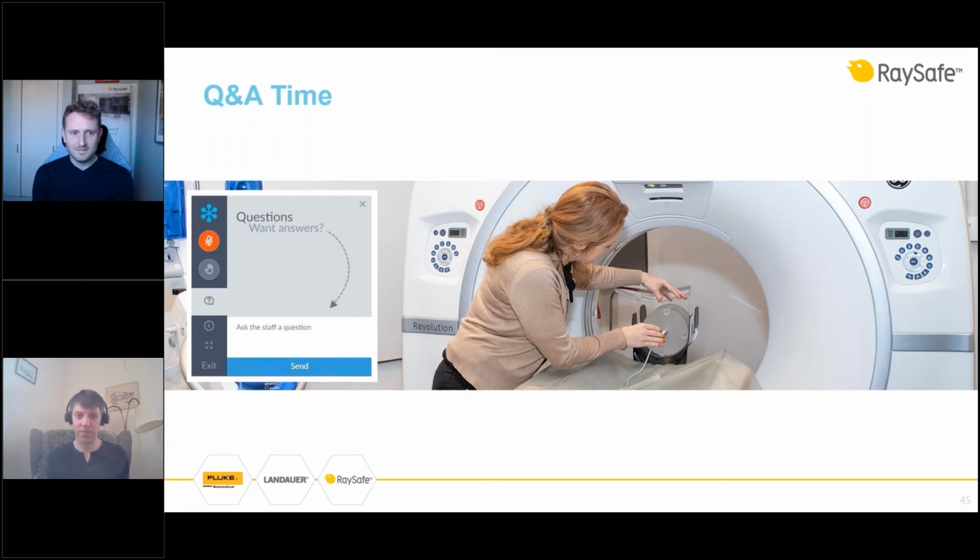Okay, thank you for that. We have another one in here. Can the CT sensor be used as a transparent sensor? Yeah, it can be used if there, for example, is automatic exposure control. But since it is an ion chamber, it will pick up backscatter. If you're interested in backscatter photons, we also have an application note on our web page on how to calculate skin dose, for example, while using the CT sensor. Or would you like to add something, Matthias?